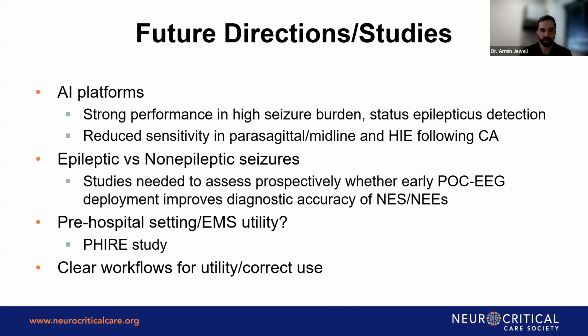Determining epileptic versus non-epileptic seizures is a different thing we didn't really talk much about. This technology isn't really used much in these cases at this point, as conventional EEG is typically more useful for these types of patients. But they need to do more studies looking at the difference and seeing if point of care EEG is a reasonable strategy to start screening for these different types of seizures.